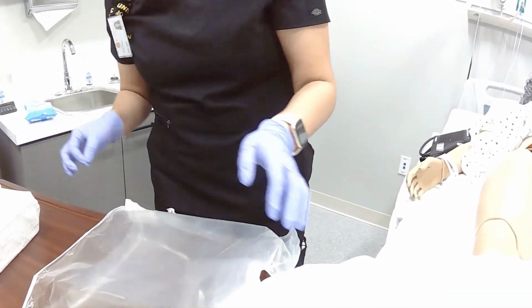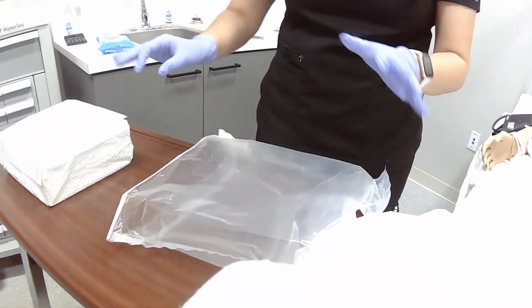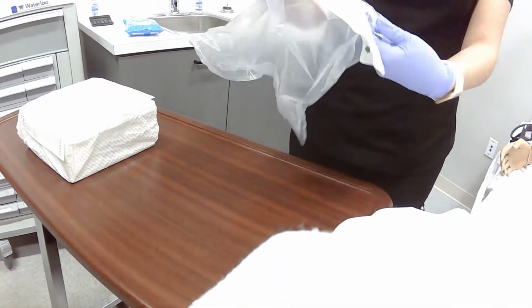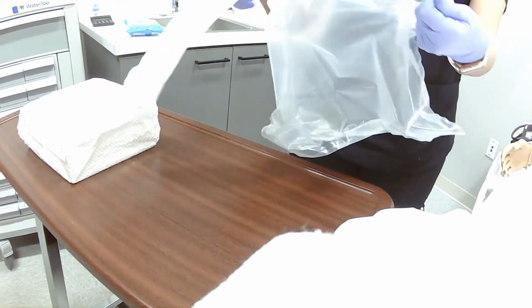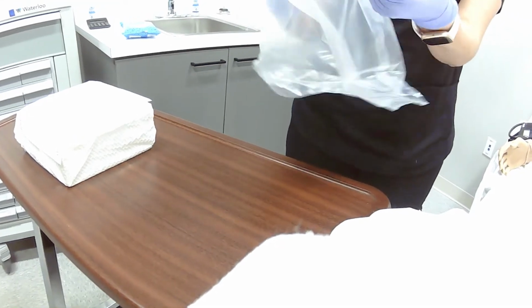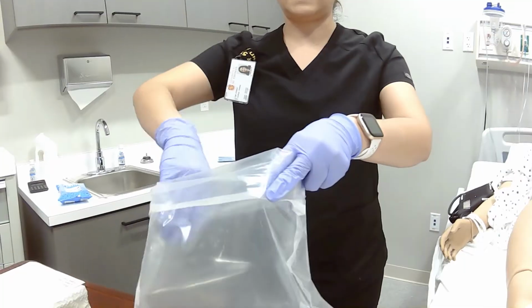Make sure that you don't touch anything else before you're sterile. And I'm just going to fold this up and throw that away. So that way it stays open and it doesn't collapse.